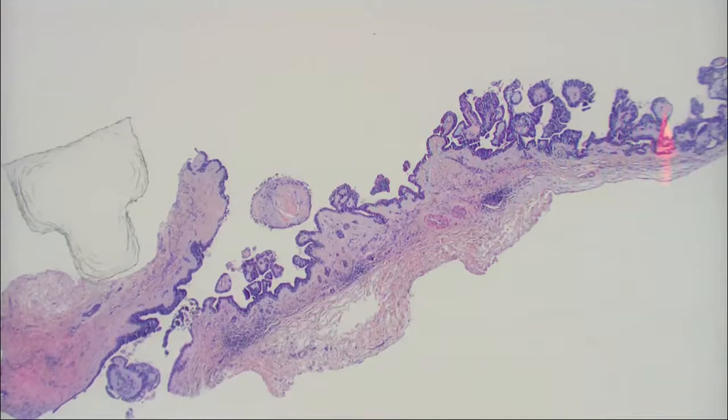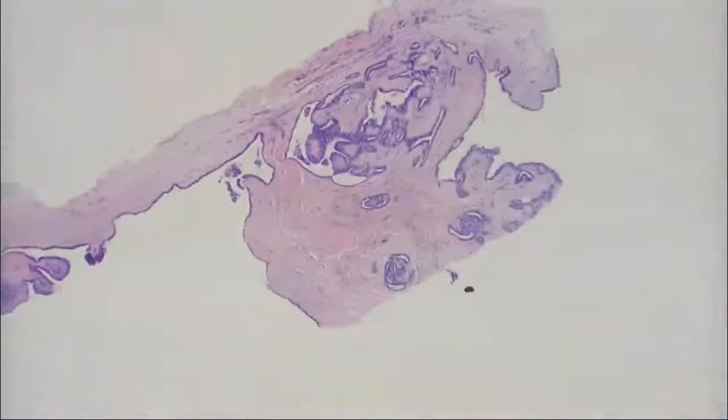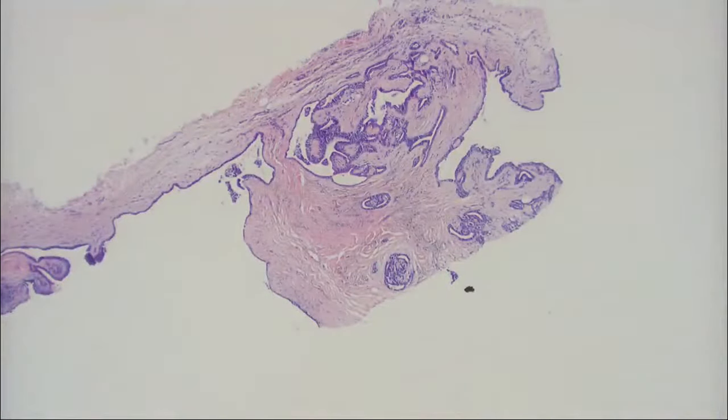I haven't learned my cysts yet. Well, you're learning it today. That's your job, to learn. So you just learned something. So this is a papillated apocrine cystadenoma. It's a great name for it, right?